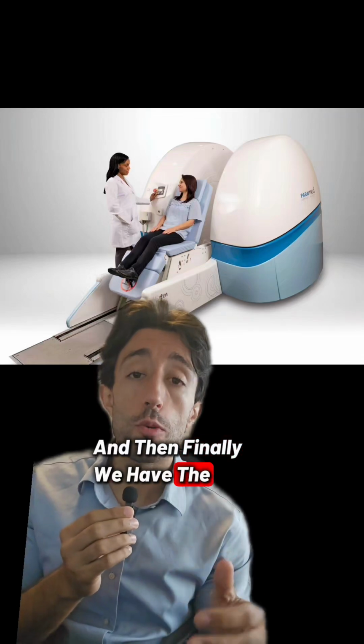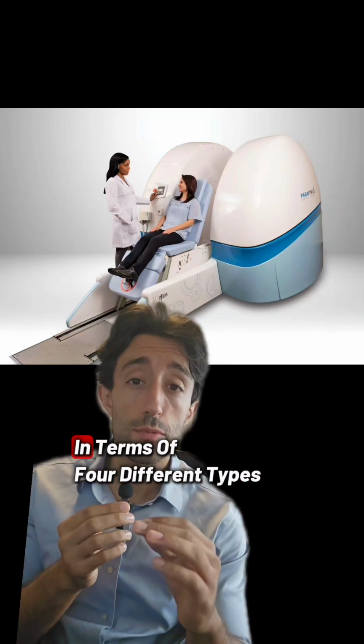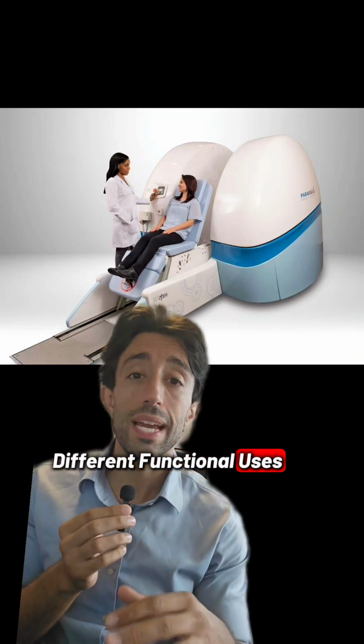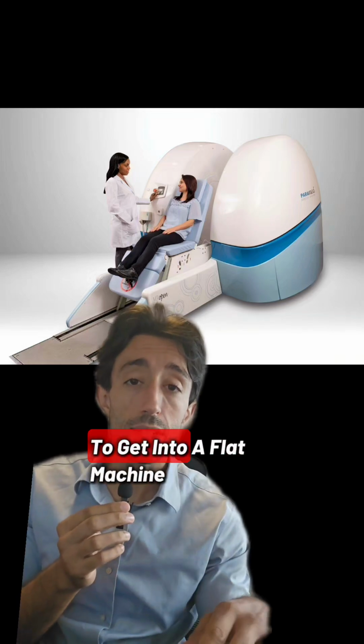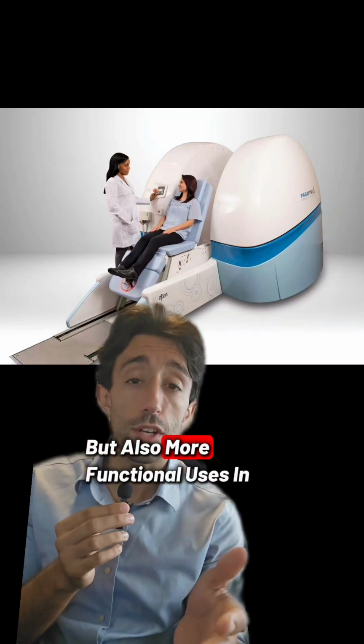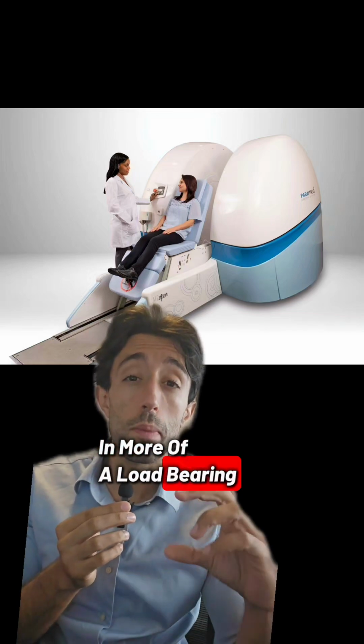And then finally, we have the open upright MRI machine. And while this is one of the lowest qualities in terms of the four different types of MRI machine, this is the one which has different functional uses. Either if someone is not able to get into a flat machine, or maybe they're not comfortable or feeling more claustrophobic, but also more functional uses in terms of what you can see in the body, because now the body will be in more of a load-bearing position.